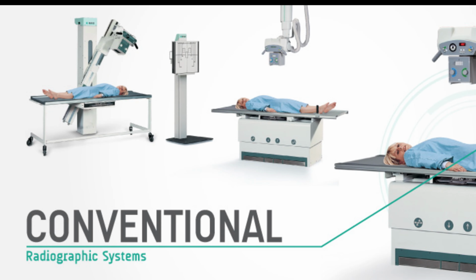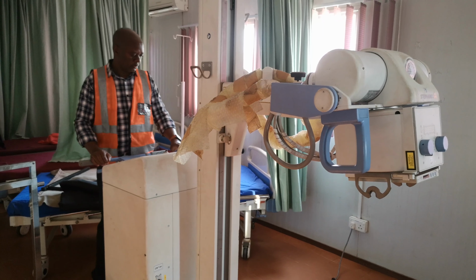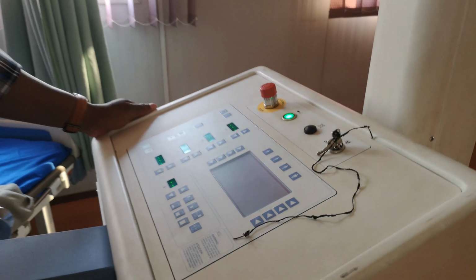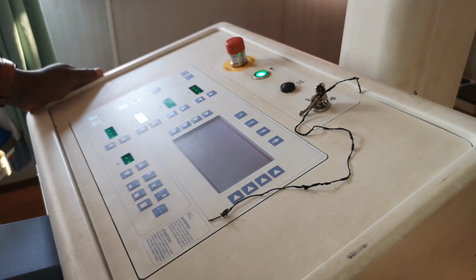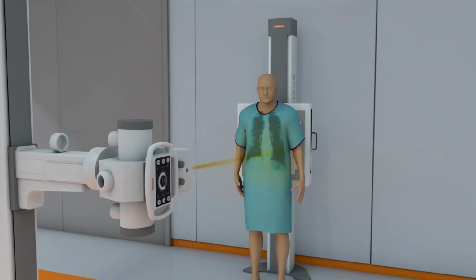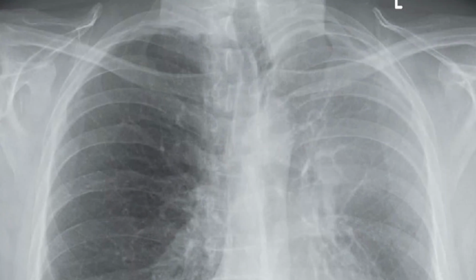Conventional radiography is another term for analog X-ray, where images are captured on film. Analog X-ray machines operate on a more manual system where X-ray beams pass through the body and expose a film that must be chemically developed in a darkroom.